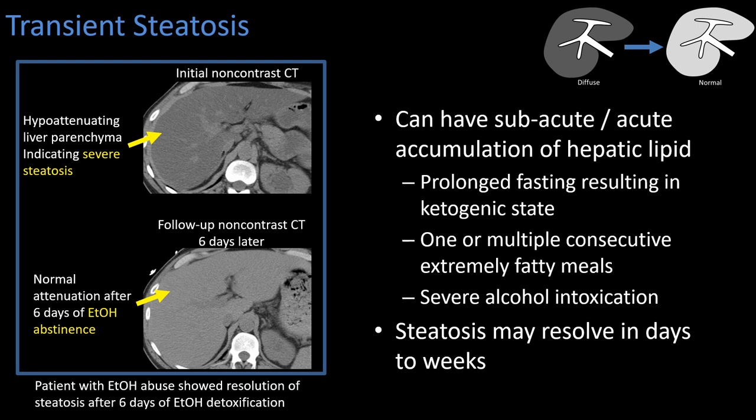Here we see an initial non-contrast CT in the setting of trauma for a patient who is acutely intoxicated. The liver is severely hypoattenuating relative to the spleen. A follow-up CT six days later shows normalization of the hepatic parenchyma — the patient had been admitted, had not had any alcohol for six days, and that steatosis resolved. It can be transient, which was relatively surprising to me when I first learned that.